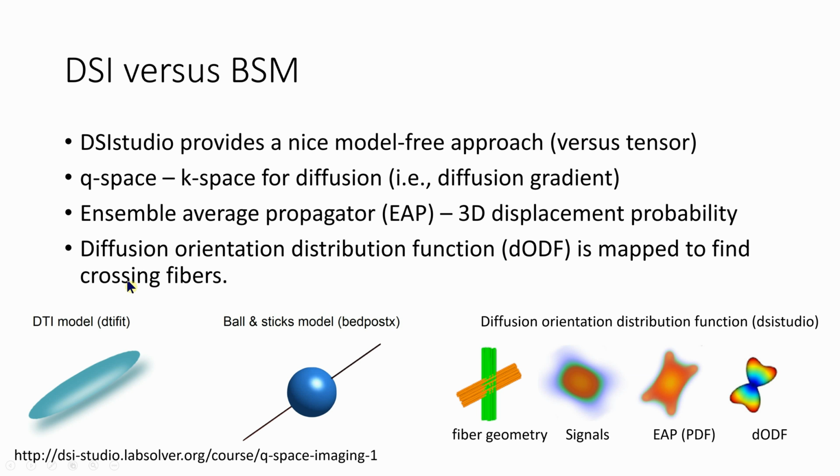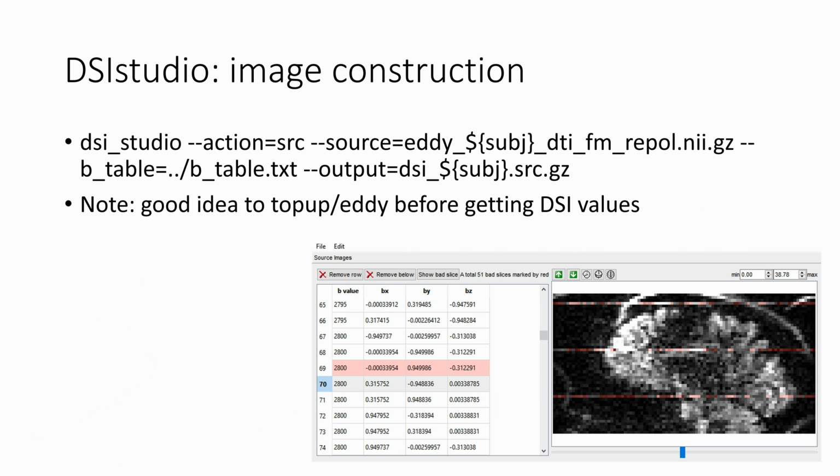Once you get that, you can then try to map out the most logical diffusion gradients that would create this model, based off the adjacency of the available data. There are various different ones that it offers, including GQI and ODF, that are basically fit algorithms. So if you model that connective path different ways, you get different fits. This you can also summate to be something representative of the FA. So representative of the path, but really what we're looking for here is to create some tracts.